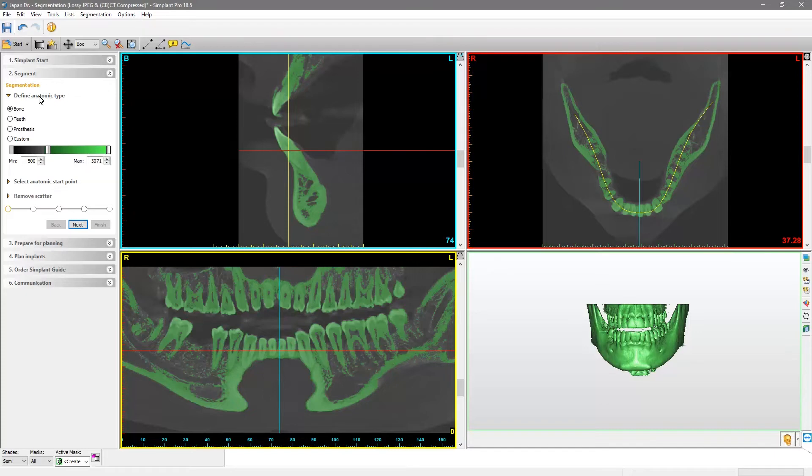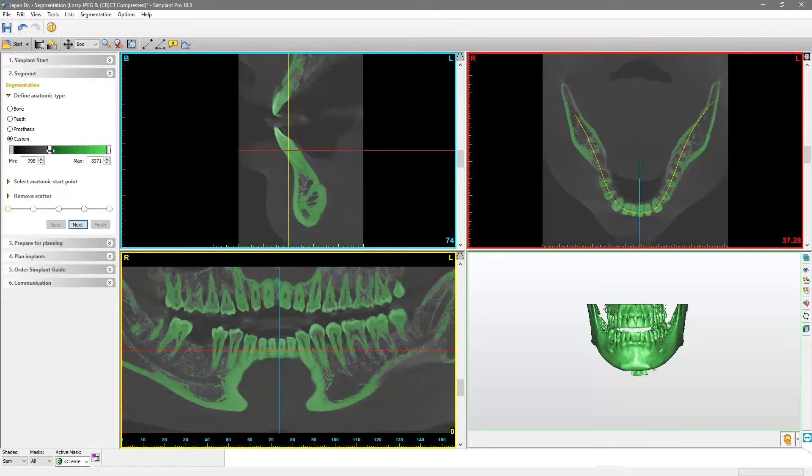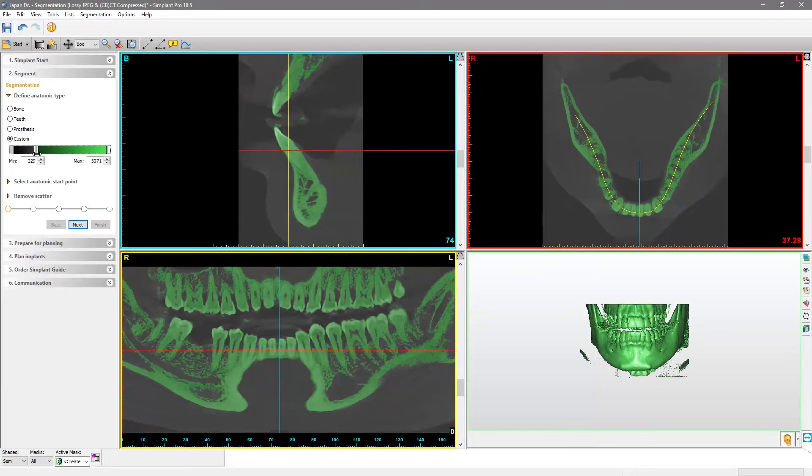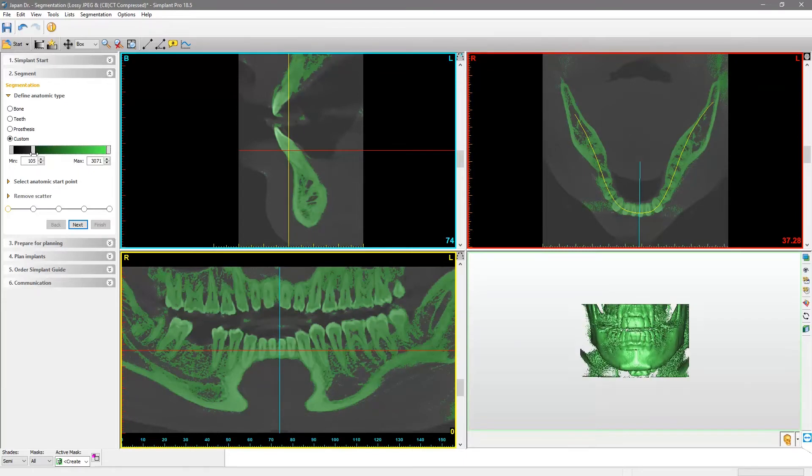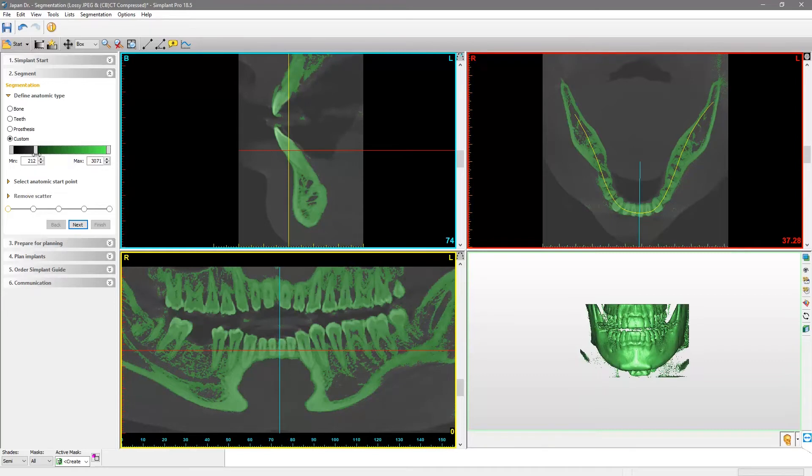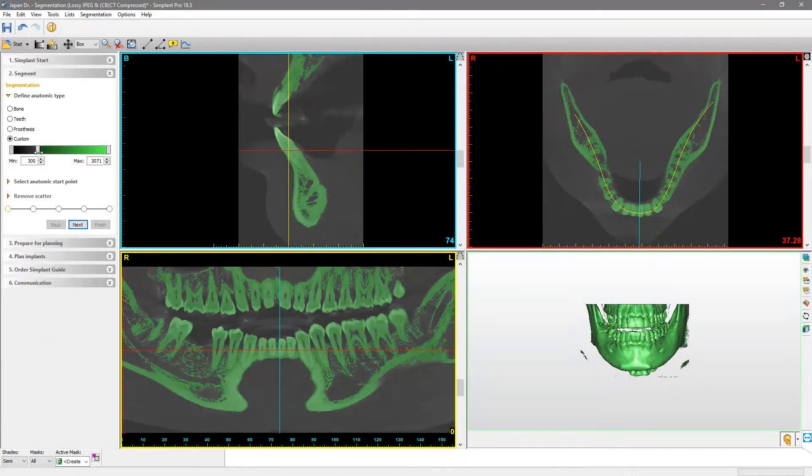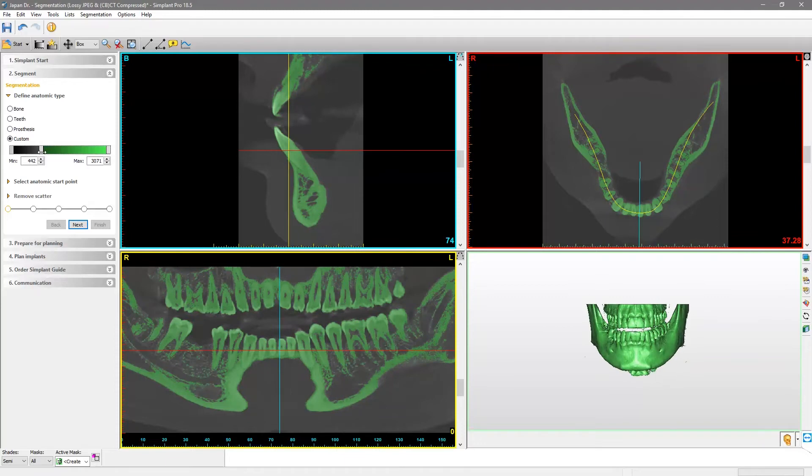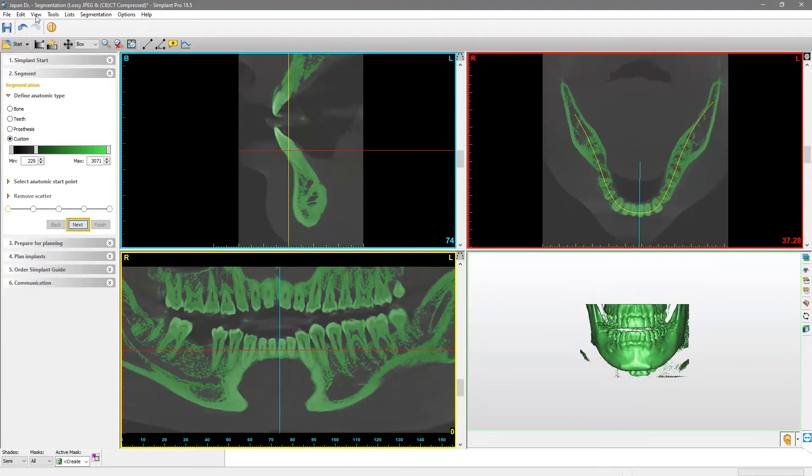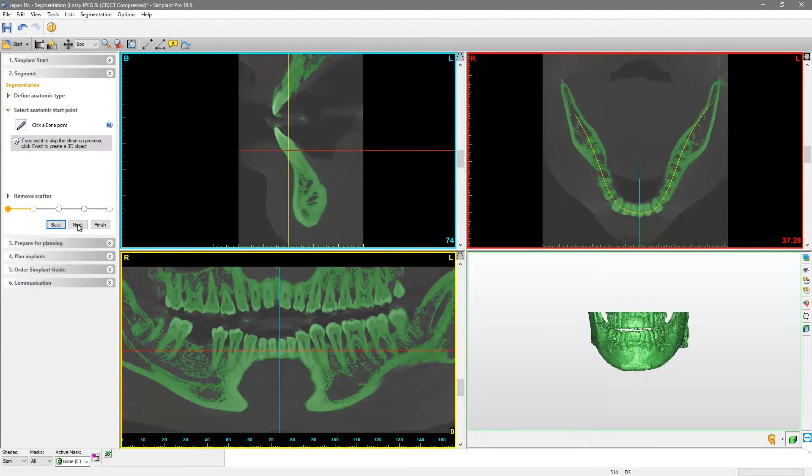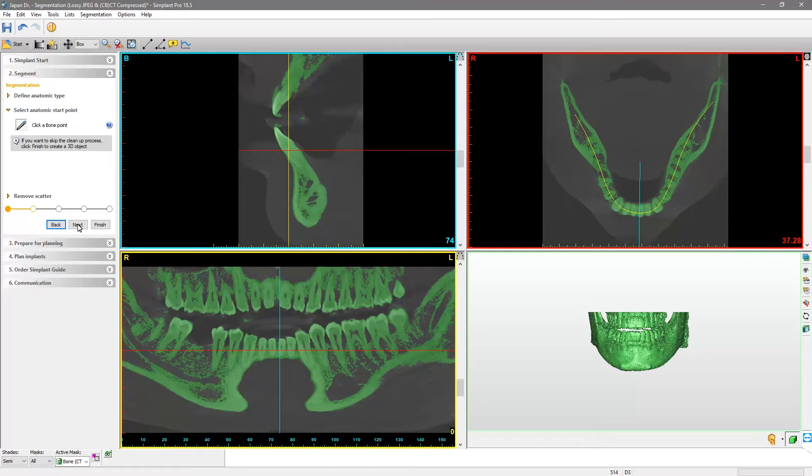Now, use the axial view to locate the area where you want to place an implant and left-click on any point representing the cortical bone. A preliminary 3D model will be created.